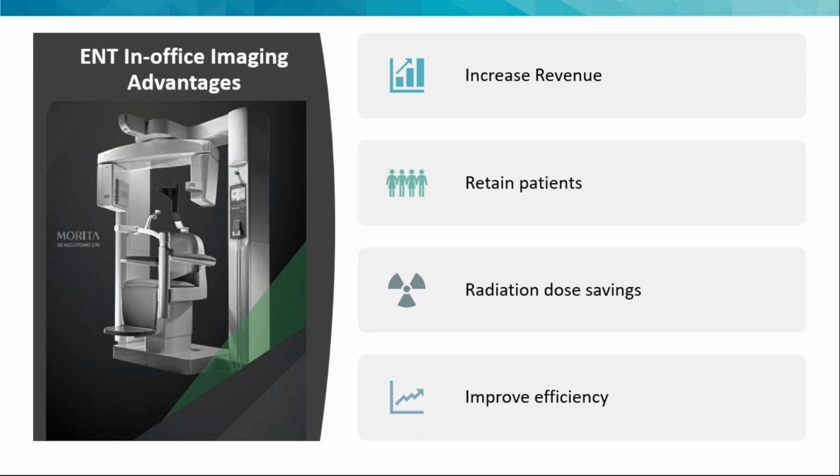In the case of ENT, on average, your dose savings is about 1/5 to 1/6 the dose for adults, and as much as 1/10 the dose for pediatric scans when you're comparing cone beam CT to a typical conventional CT scanner at the hospital. So just to clarify, when you say there's 1/5 or 1/6 dose saving, you don't mean the dose is reduced by 1/5 or 1/6. You mean that the dose is reduced by a factor of 5-fold or 6-fold to a total. That's correct. Okay. Thanks.